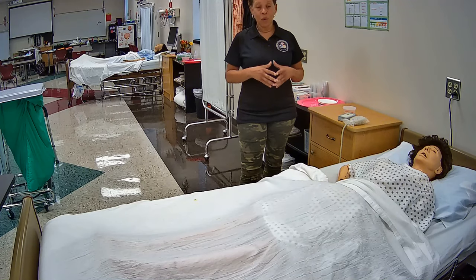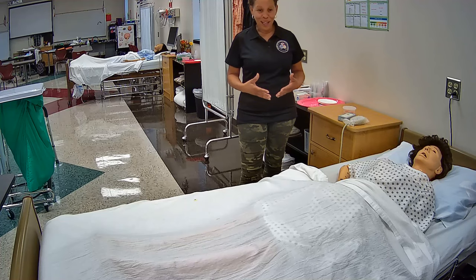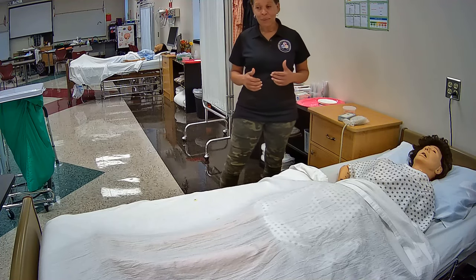In this video, I'm going to be demonstrating for you the Prometric testable skill: catheter care. I will be giving you explanations to everything that I do and why I do it. So let's go ahead and get started.